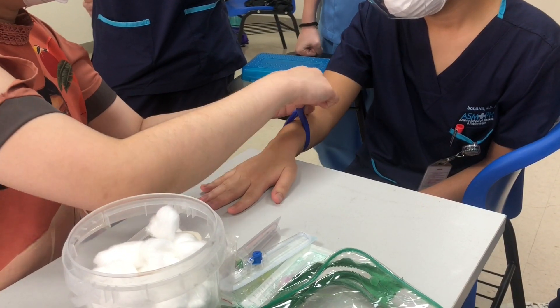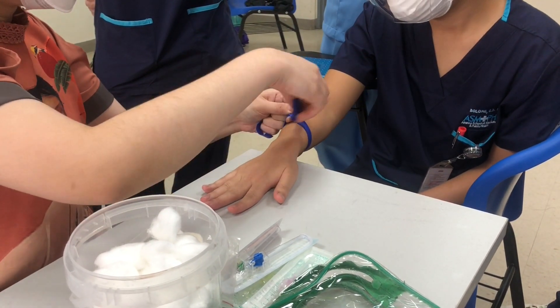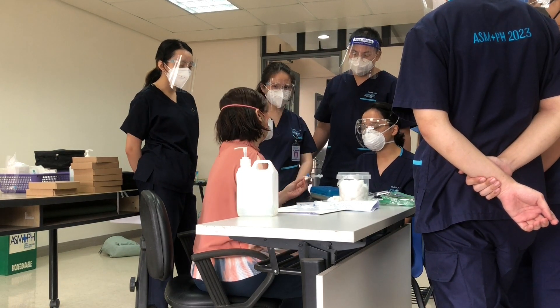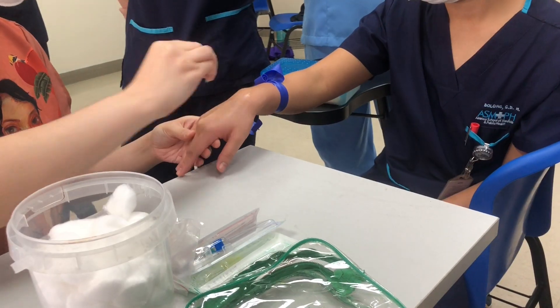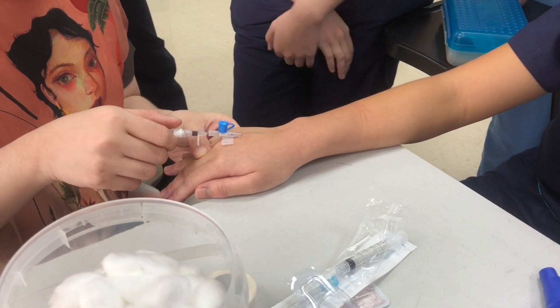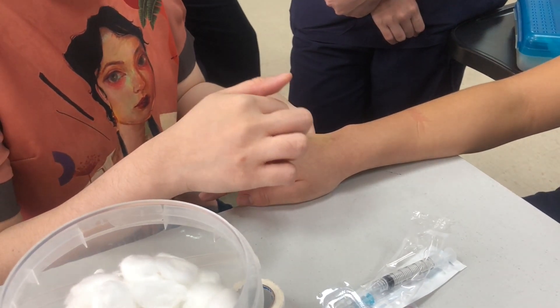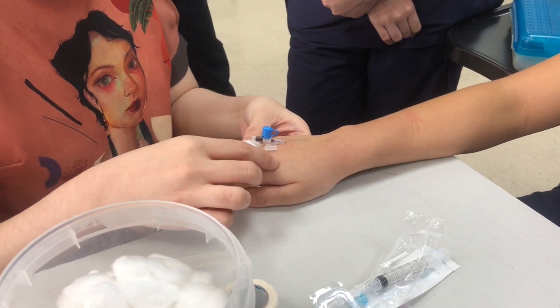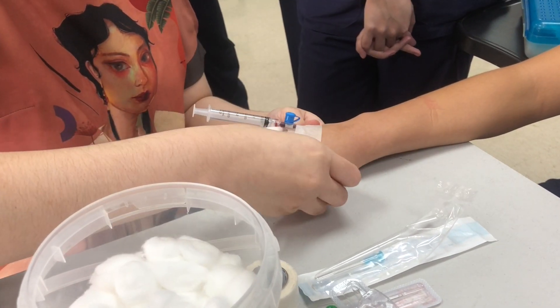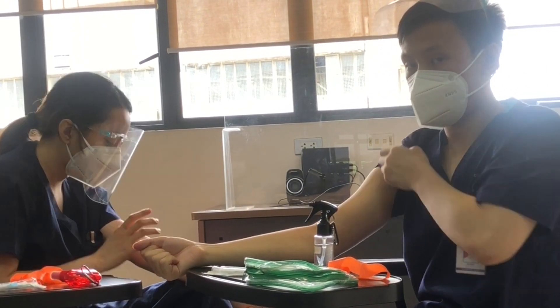Here we see my professor demonstrating the steps on how to insert an IV cannula into a patient's hand before letting us practice it on each other. The importance of this is that it allows us to not only practice how to do the steps properly, but also gain an idea of what it feels like to undergo these procedures so that we can empathize with the patient if they feel pain. This applies to phlebotomy as well, since it's a procedure we'll be performing a lot during clerkship and internship.